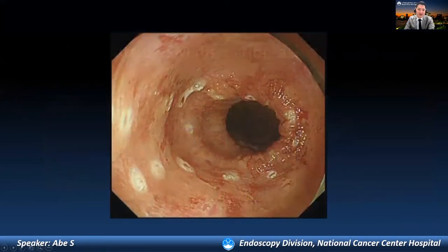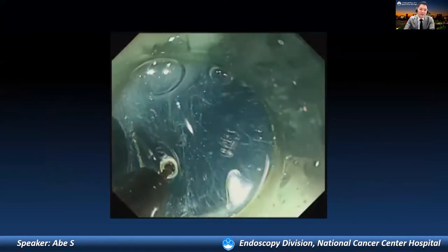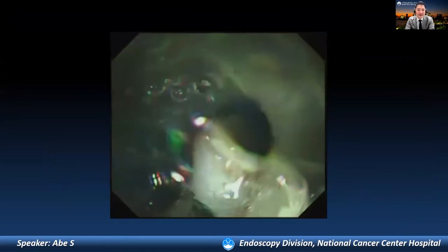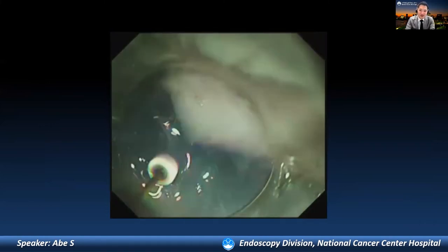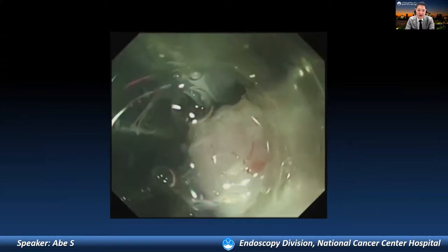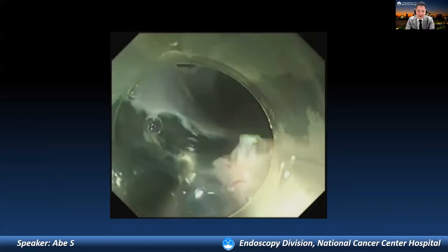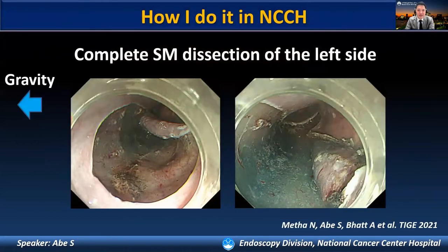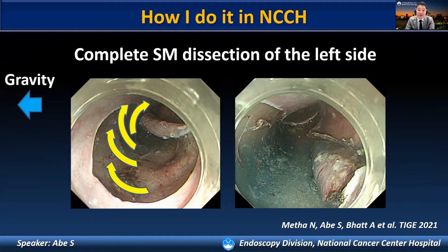Let me show you the video. Because the submucosa of the esophagus is soft and loose, we apply the ceramic tip to the submucosal and dissect the tissue from inside to outside. This procedure allows us to identify the edge of the submucosal and the muscle direction. We can also dissect submucosal distally while advancing the IT knife nano and the gastroscope. We complete submucosal dissection of the left distal side until the distal end — the most challenging part of esophageal ESD. In contrast, the right side is easier because it is naturally opened and exposed due to gravity.